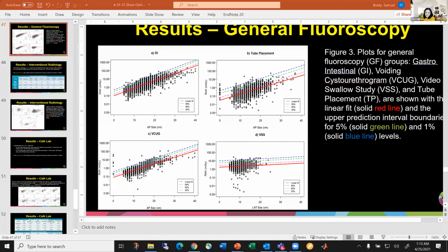Well, there is one comment. It's the same comment that maybe we need to check on the units when we collect those things, and maybe that is the one thing that we should reiterate to our group when we do manual collections. But that issue should be resolved when we have measurement software that directly sends all information. And I mean, you kind of said it. That's the hardest part about doing all the manual collection. At first, it's the most important part to start the process, and you guys have been doing that.